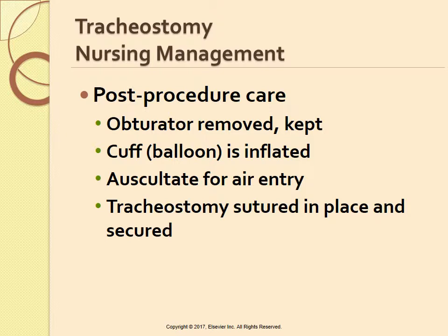Immediately after the procedure, the cuff or the balloon is inflated. The patient's chest is auscultated for air entry. Air entry should be heard in all lung fields. The tracheostomy tube is sutured and secured in place with cotton tracheostomy ties, tracheostomy tapes, or Velcro straps.